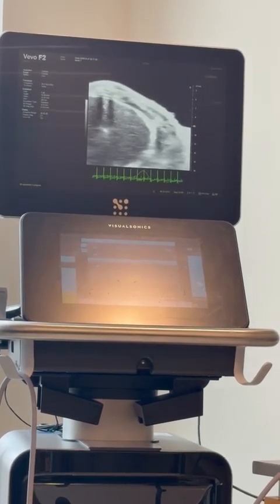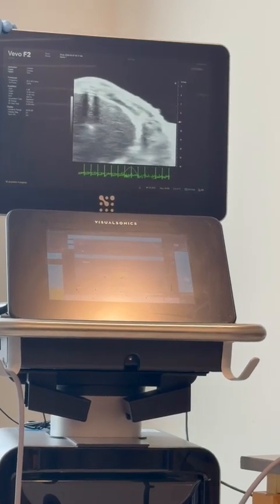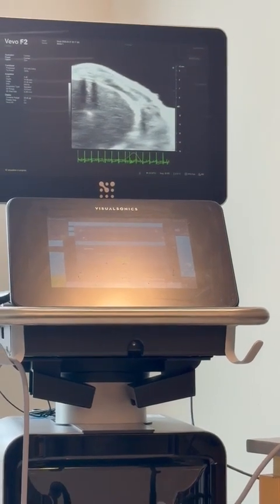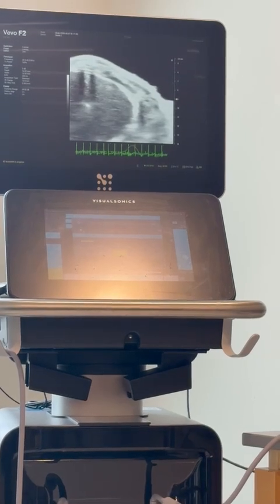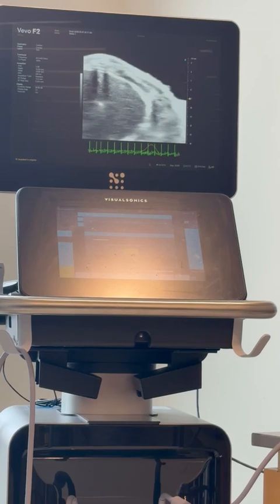It's moving now, so you can actually see what it's doing is it's taking a series of B mode images throughout the scan distance that we set, and they're not images, they're movies. So a B mode movie at each plane, and then it's going to bring them back into a 3D image that we can actually play and watch a beating heart.